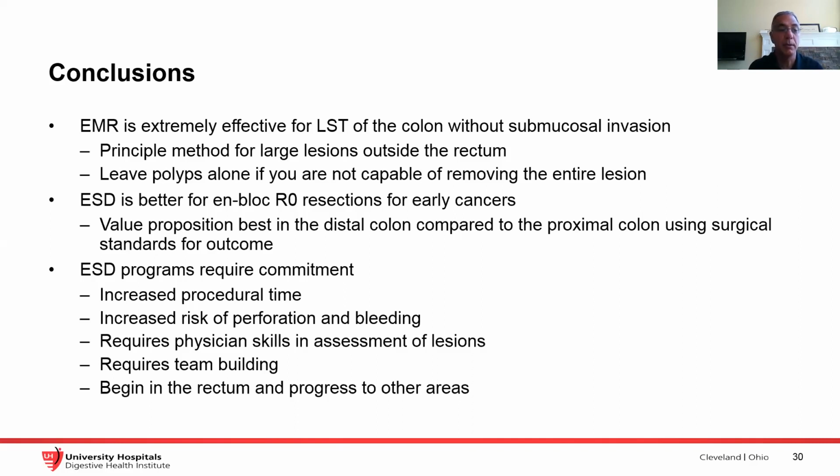And then ESD programs require commitment. There's increased procedural time. There's increased risk of perforation and bleeding. It requires physician skills and assessment of lesions beforehand. It requires team building. And if you're going to take this journey with us, begin in the rectum and progress to other areas.